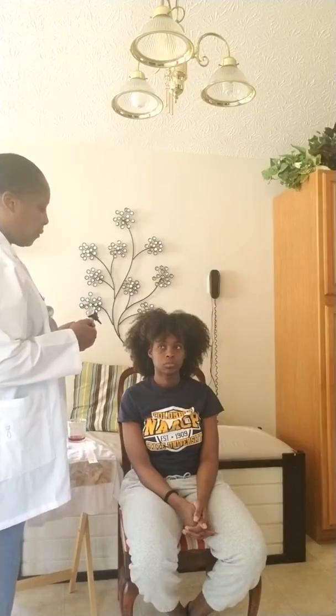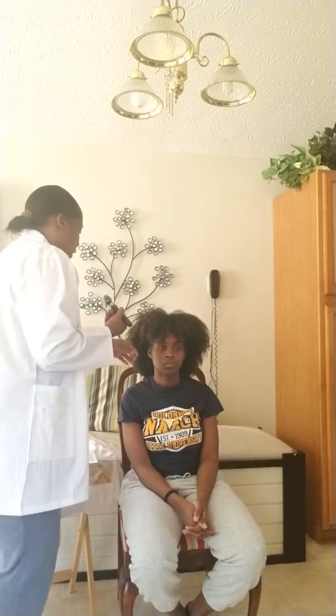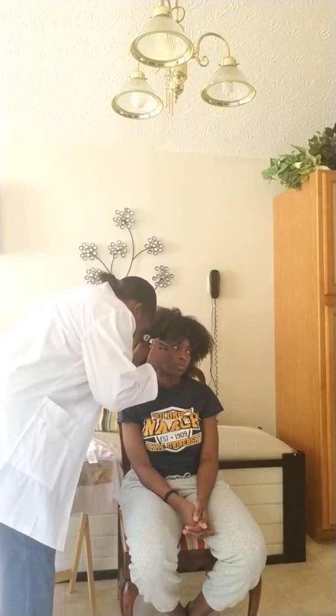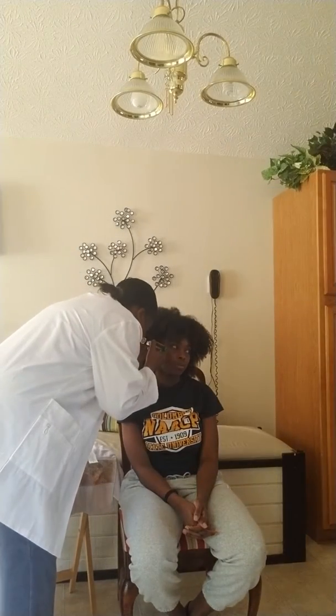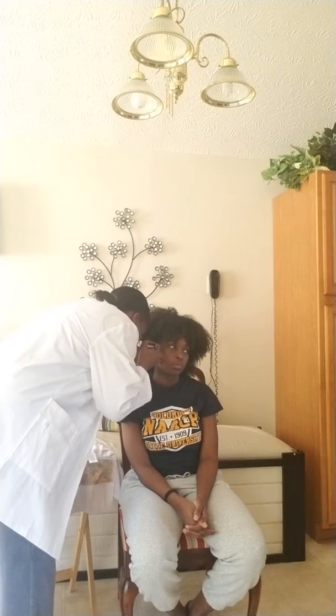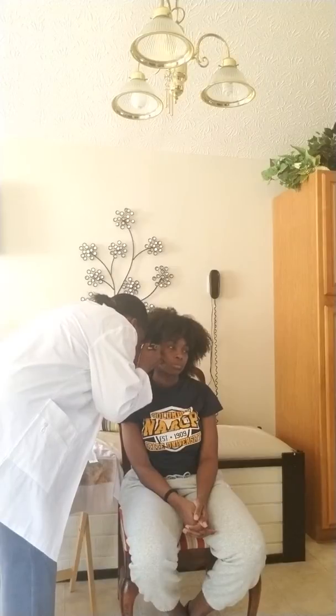As I go in, I'm going to be observing the ear canal until I get to, if you turn your head to the left, okay. Let me know if you get uncomfortable, okay? Okay. And I'm going to be assessing the ear canal to make sure I don't see any rashes, any redness, any drainage.